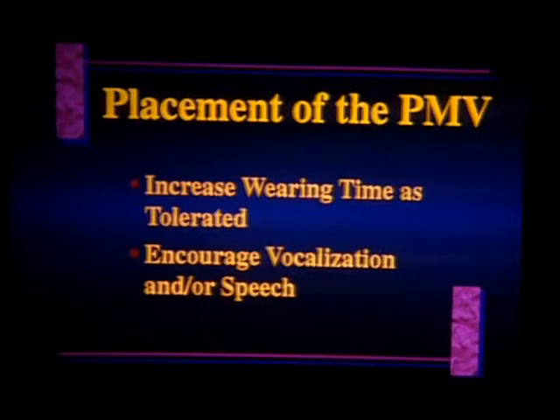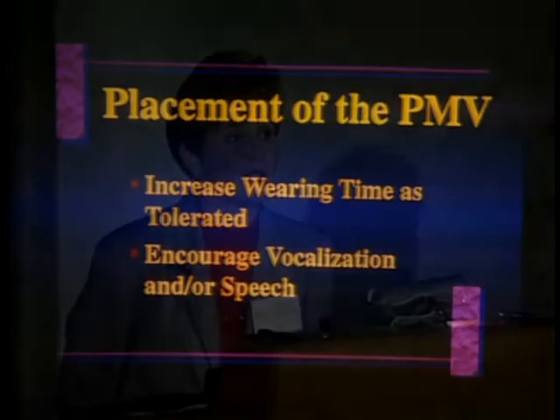You increase the wearing times as tolerated. Begin to encourage vocalization and or speech, just through your normal practice. Now, to demonstrate the encouragement process in pediatrics, I've got a young boy by the name of John. I have a little description on there. He had bronchopulmonary dysplasia and tracheal stenosis, so he could wear it for short periods of time, not all the time. But I'll let you look at the encouragement that was necessary for this young man.